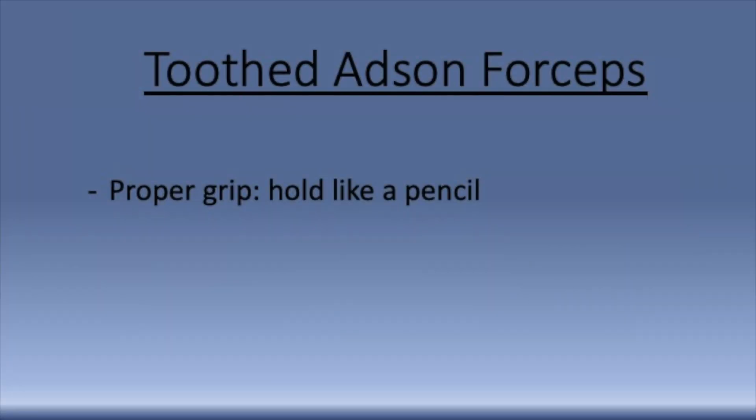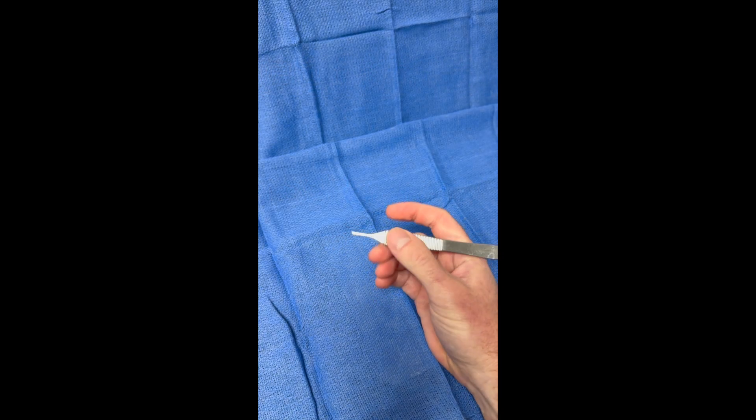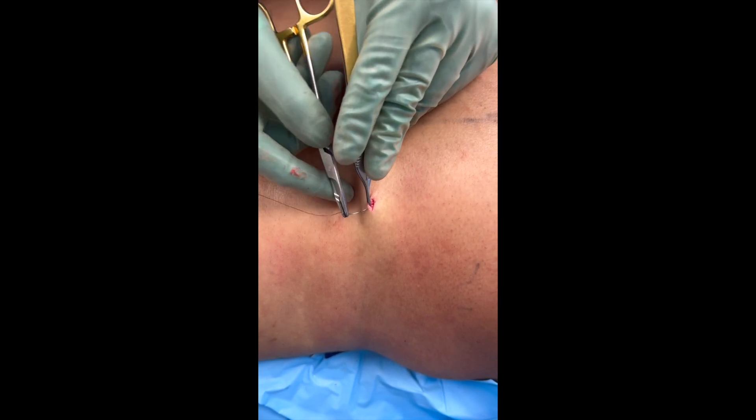The best way to hold the toothed Adson forceps is to hold it like a pencil, pinching it between your thumb and your index and middle finger. This gives you better control of the instrument and allows you to be more precise with your suturing.